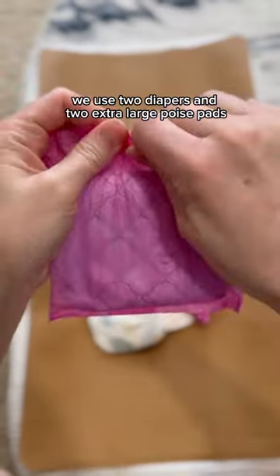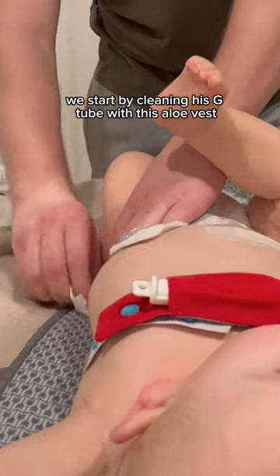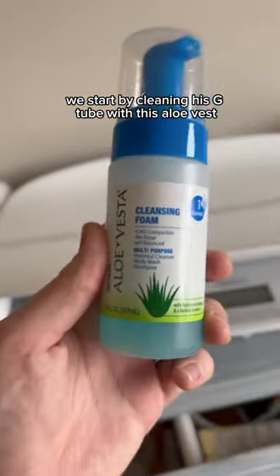Why on earth do we use two diapers and two extra-large poise pads for our son's diaper change, you may ask? I'll tell you in a sec. For diaper changes, we start by cleaning his G-Tube with this Aloe Vesta stuff and a washcloth.